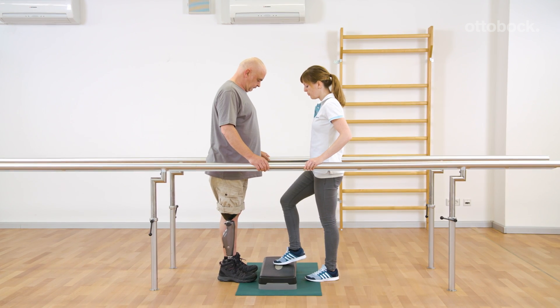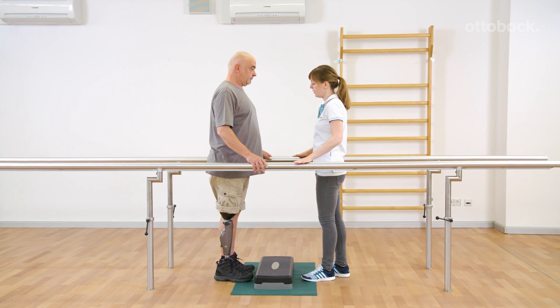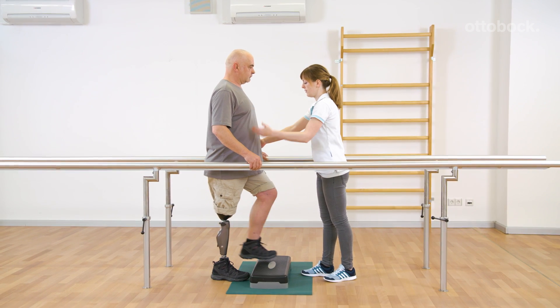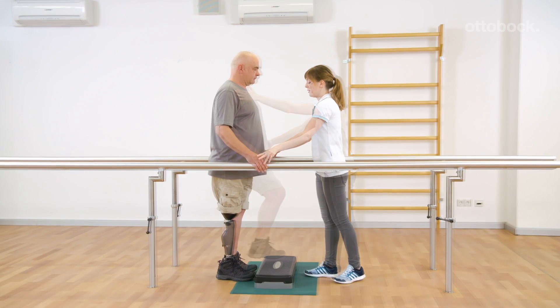A good stance phase is the basis for a secure gait. The load is shifted to the prosthetic side during the first exercise. The upper body stays upright. The trunk should not lean laterally and the pelvis should not drop laterally.